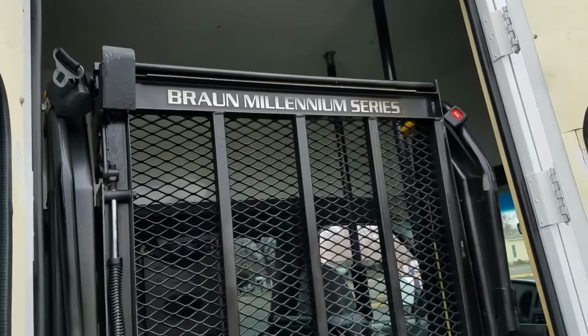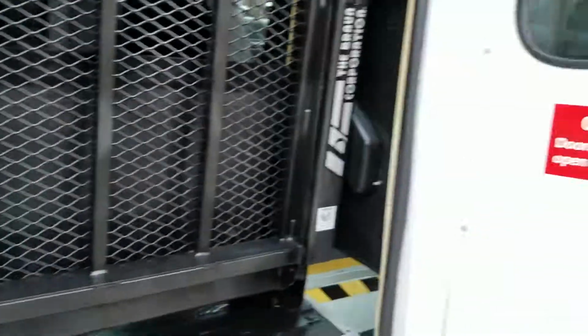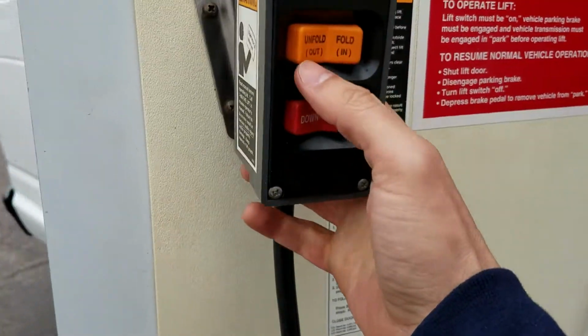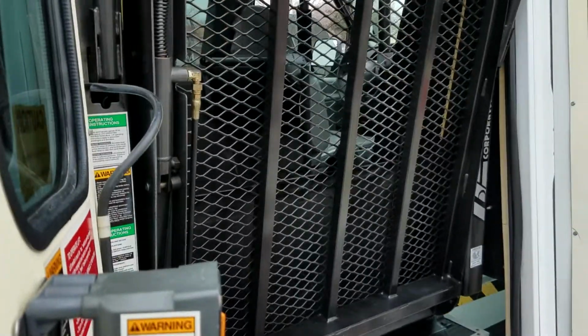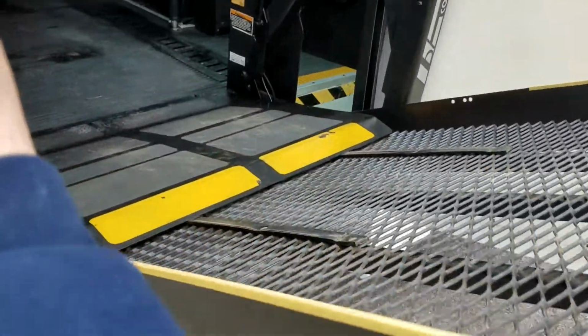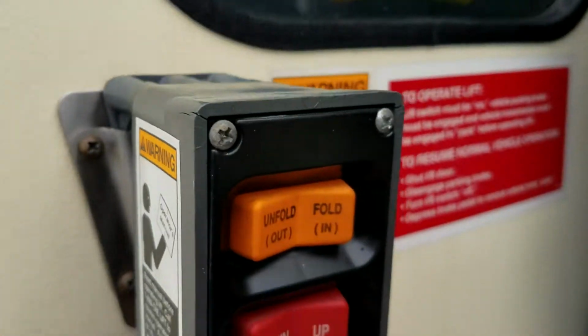It's got the Braun Millennium Series lift to operate it. Very easy to do. Have to make sure the vehicle's running, the emergency brake is on, and there's a switch for the lift in there. Three things you have to do to make sure. Then you can pull this out and hold it in your hand if you want, or you can hold it here, but unfold the ramp. I'm sorry, the lift. There's a difference. Hold it until it stops, and then we're gonna hit the down button.